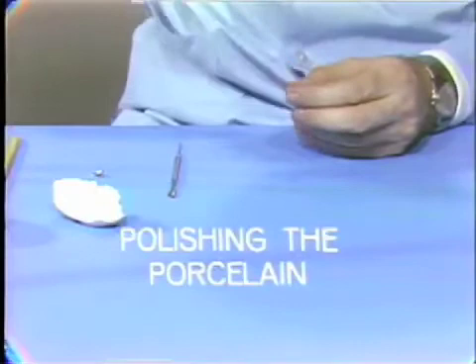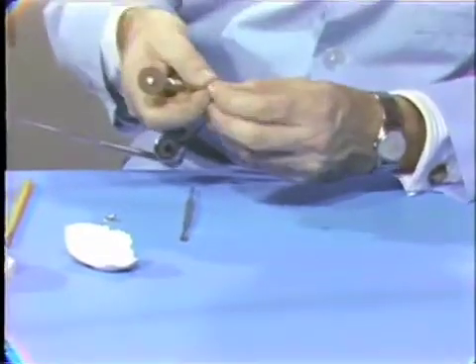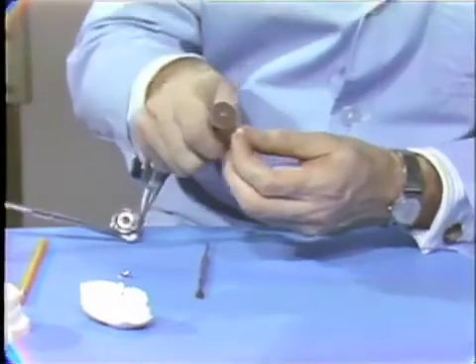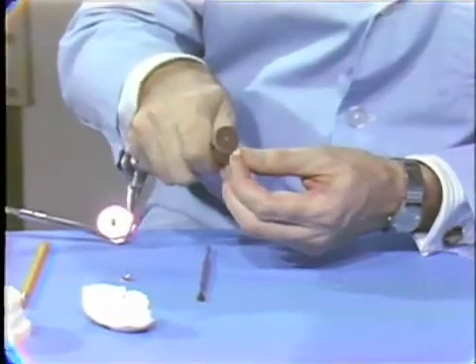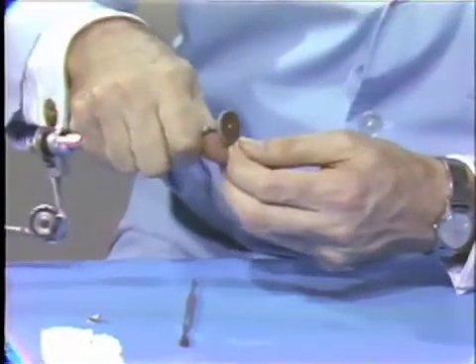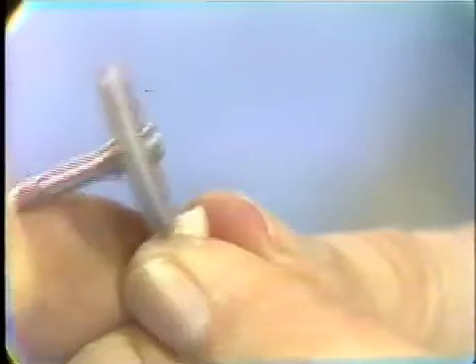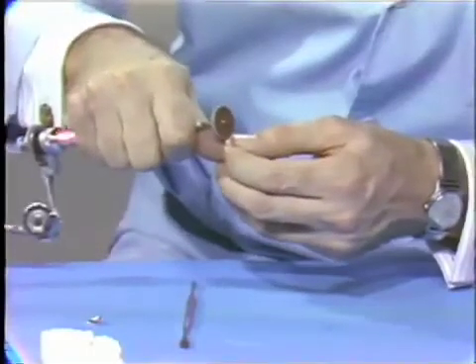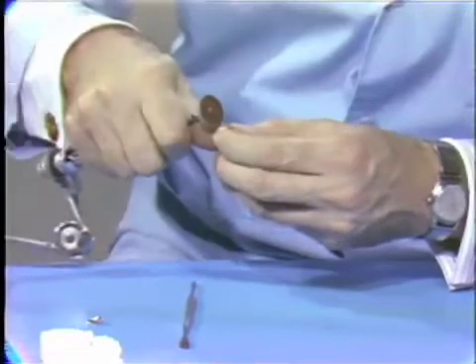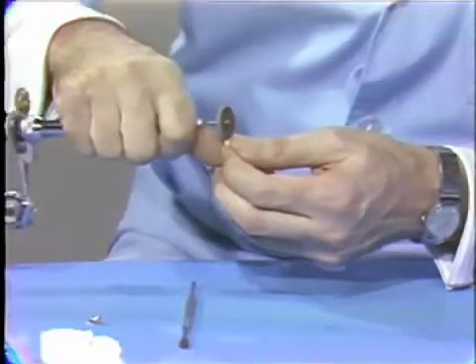The initial polishing to remove the marks made by the carborundum grinding wheels is best done with a medium-grade rubber wheel, Cratex medium grit rubber wheel. And this is applied to all of the ground surfaces, and it doesn't matter if it runs over a little bit onto the unground surfaces. And these are thoroughly smoothed down. This will take out the slight roughnesses and irregularities that the coarser carborundum grinding wheel creates in here. And this takes a few minutes just to go over all of those cut surfaces and smooth them down nicely.